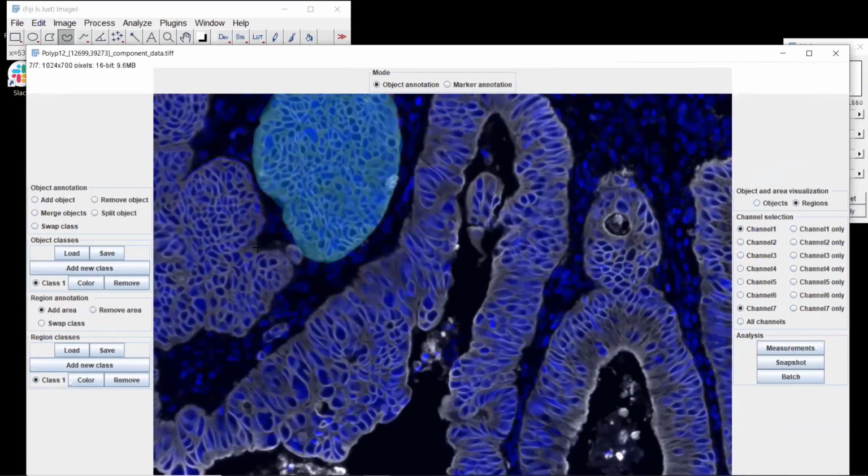Say, I want to annotate this as another. So if you go outside, you just take everything that is inside this. And then, for example, here I want to have epithelium, stroma, and also background, because sometimes you have a part of your image that is outside the tissue.